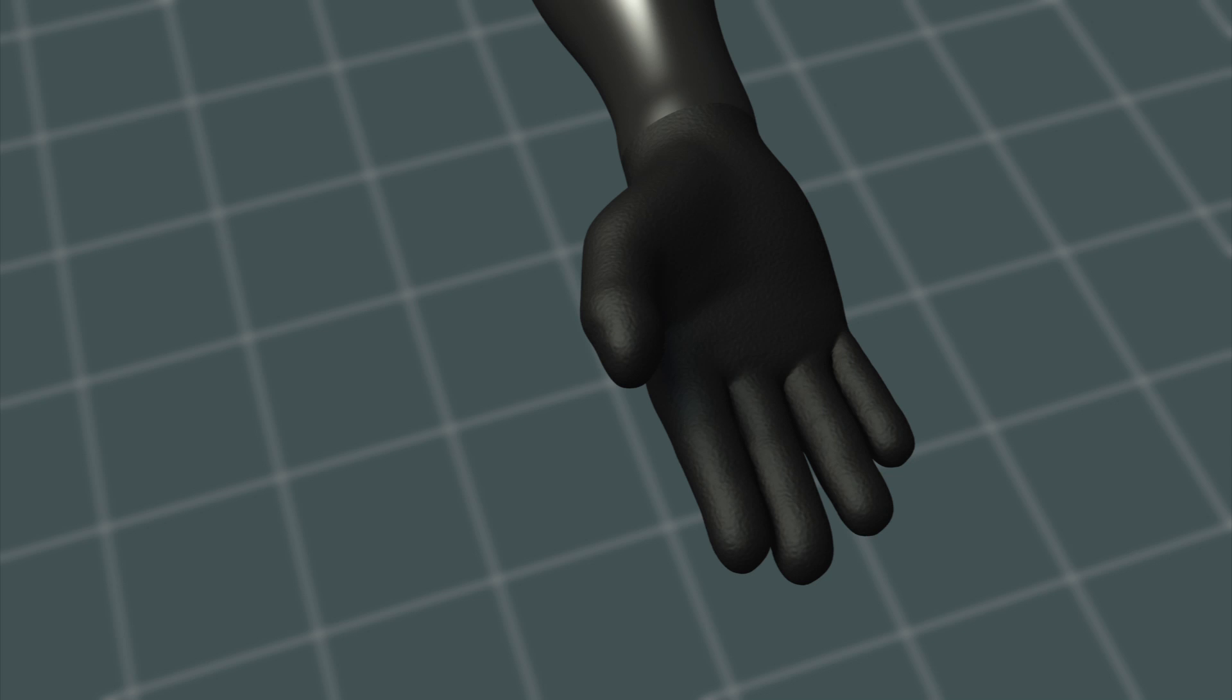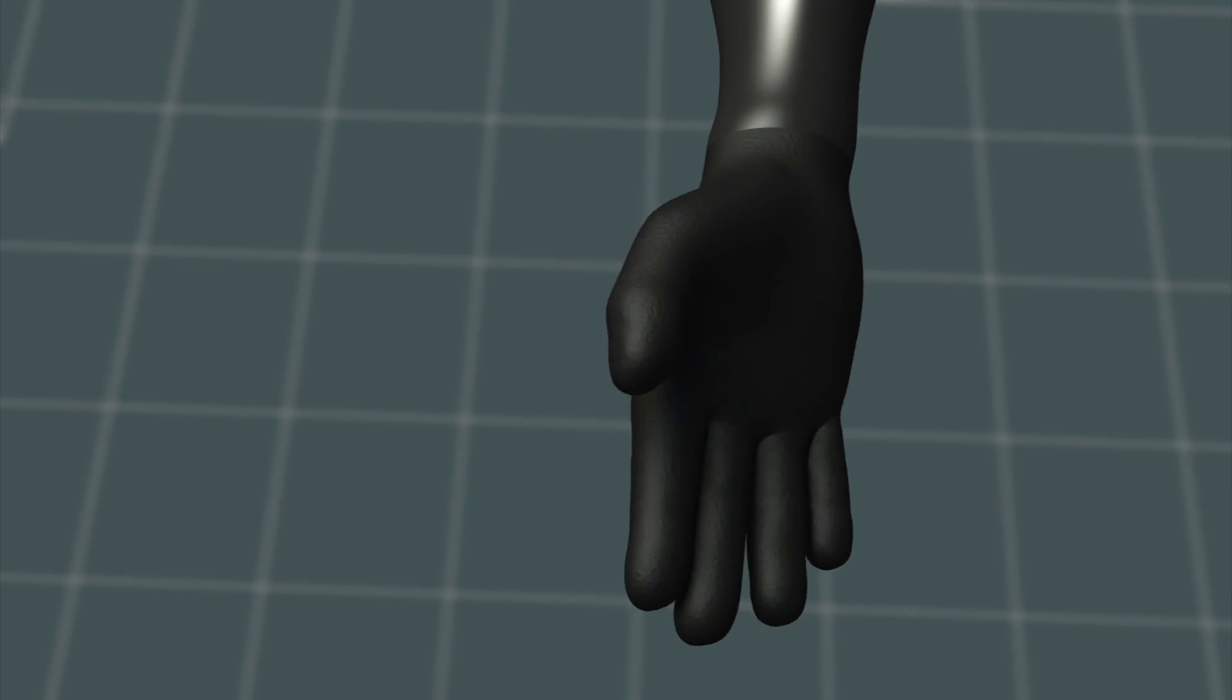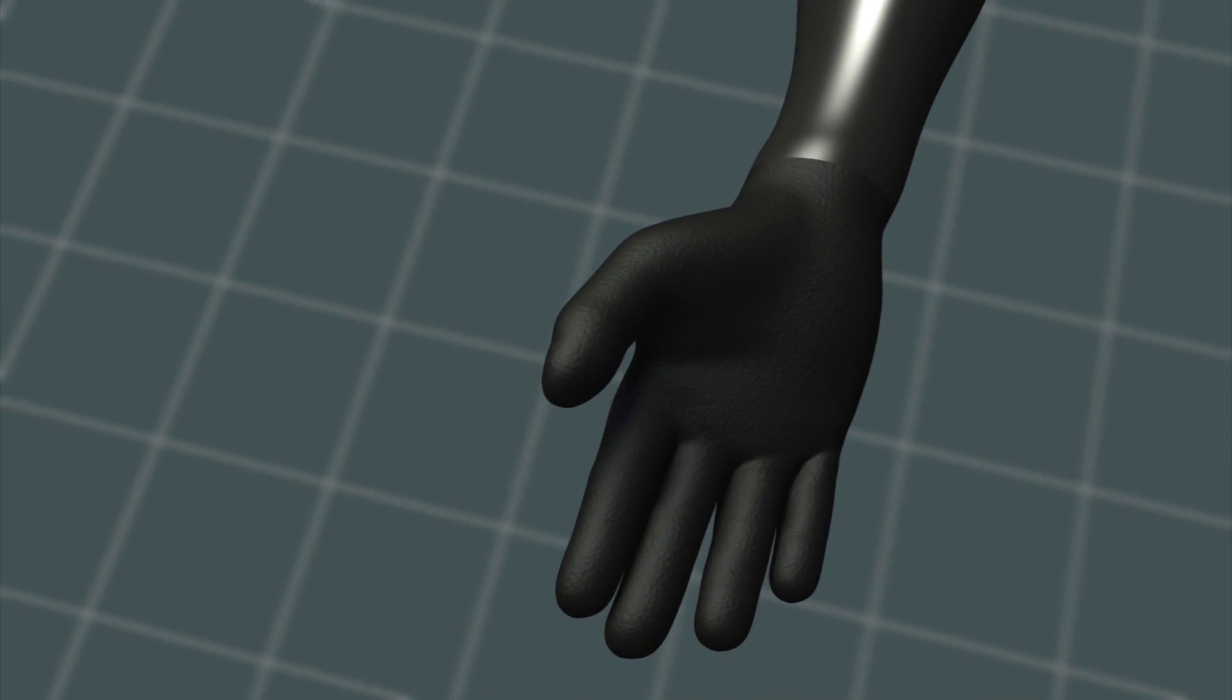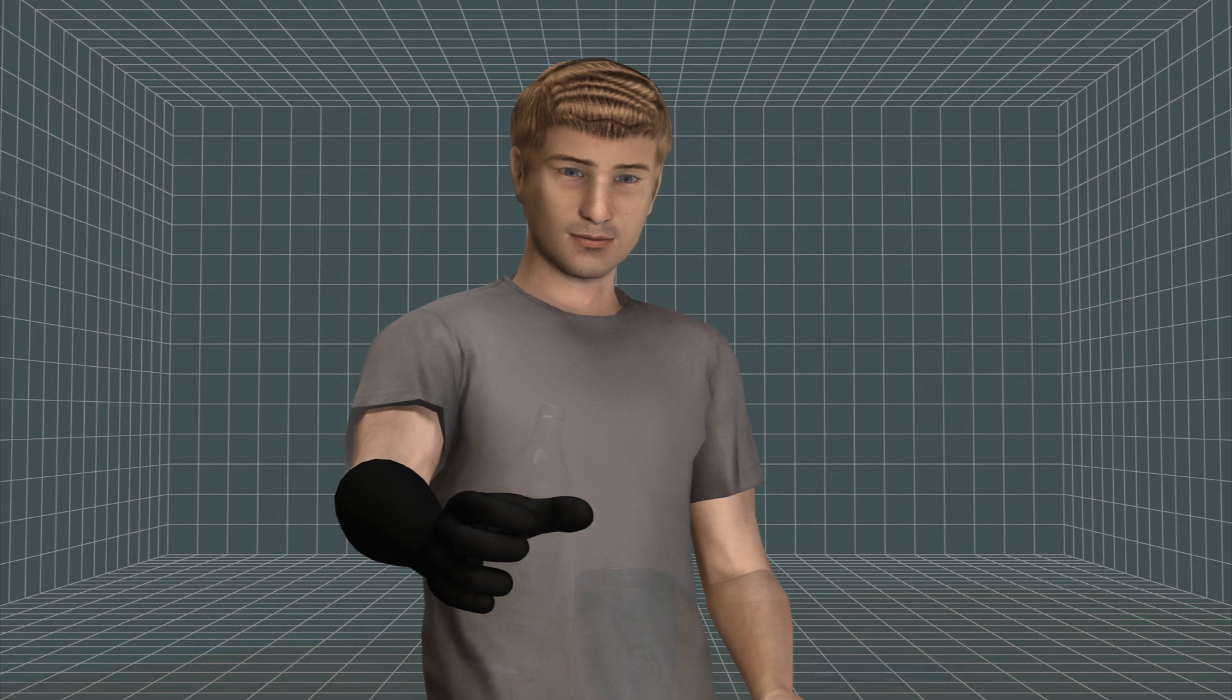The system allows for three degrees of movement: opening and closing of the hand, rotation of the wrist 180 degrees clockwise and counterclockwise, and lateral movement of the thumb, allowing the patient to easily perform daily tasks.